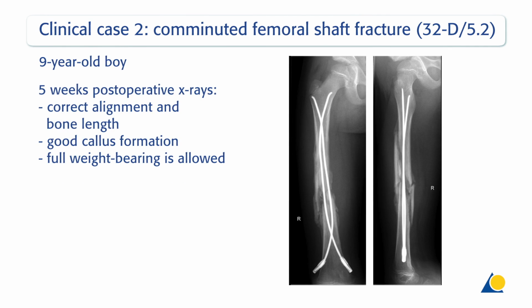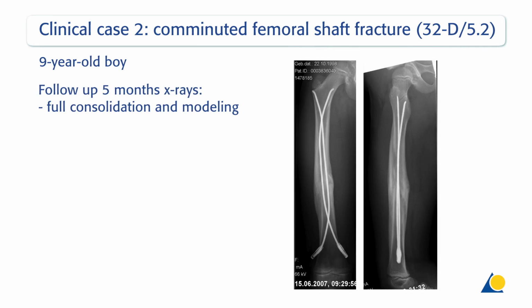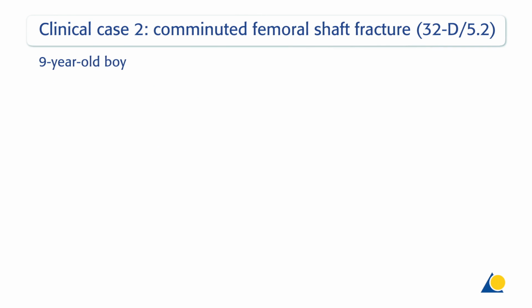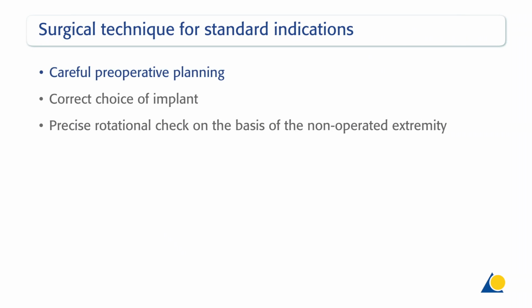The 5 weeks postoperative X-rays show correct alignment, bone length, and good callus formation. Full weight bearing is allowed. The 5 months postoperative X-rays show full consolidation and modeling. The 8 months postoperative X-rays after nail removal are shown here. In general, careful preoperative planning, correct choice of implant, and a precise rotational check on the basis of the non-operated extremity are crucial to achieve a successful clinical result.